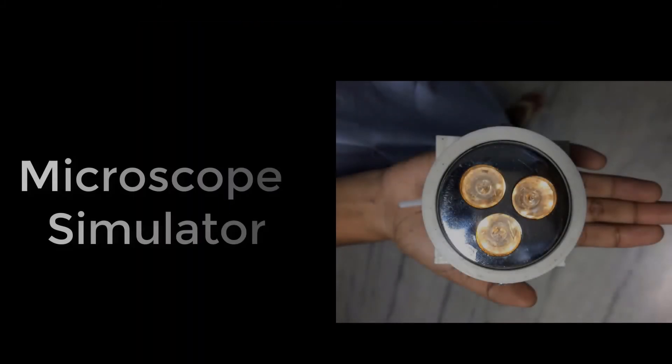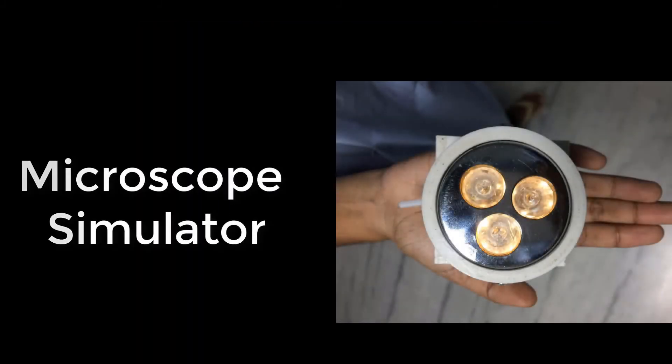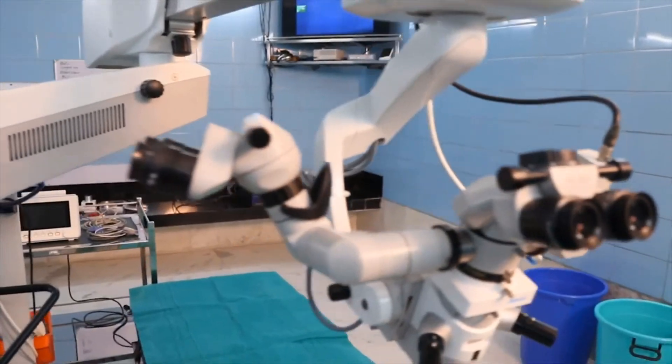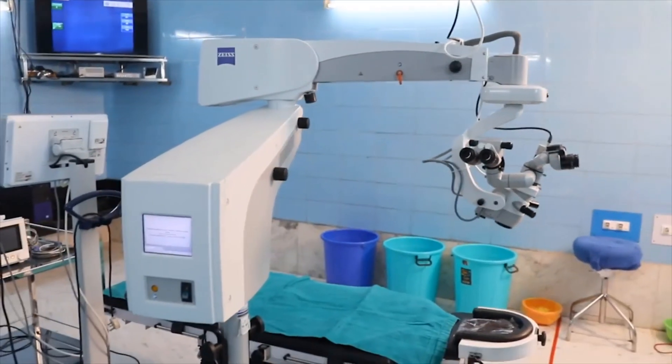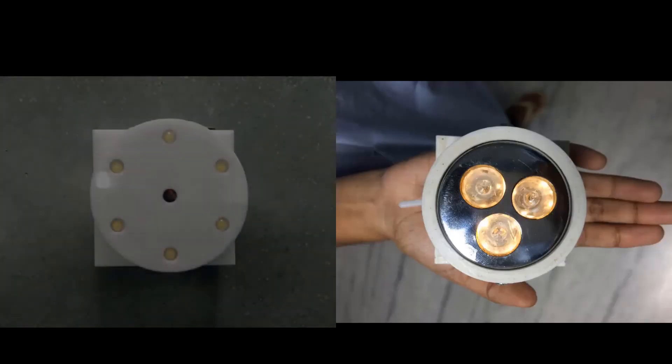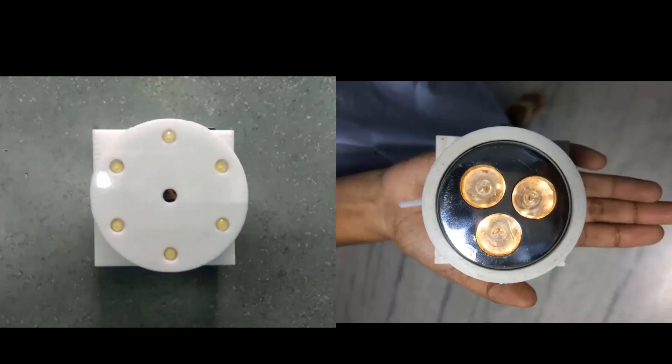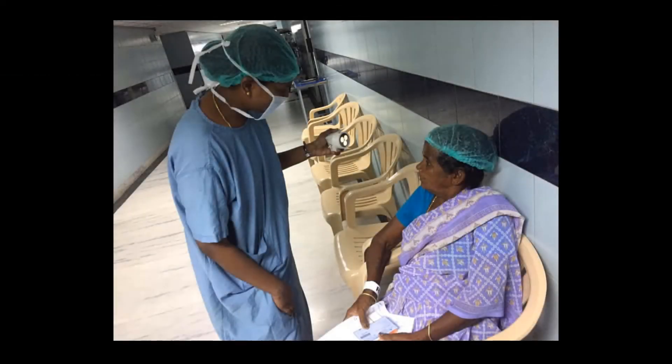Microscope Simulator or Simulator Box. To avoid the confusion for patients to focus on the light during phaco and FLACS and help them focus, we have devised two simulators mimicking the light source of operating microscope and FLACS laser which are shown before surgery to help the patients to know what they see and what they must focus.